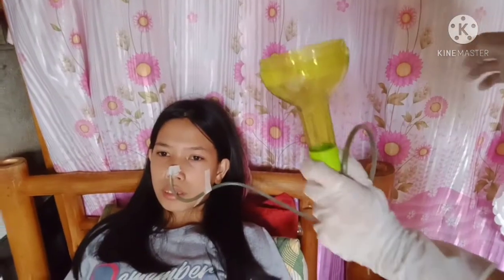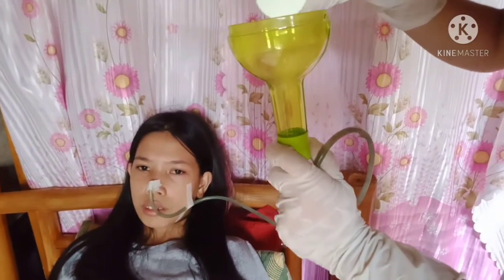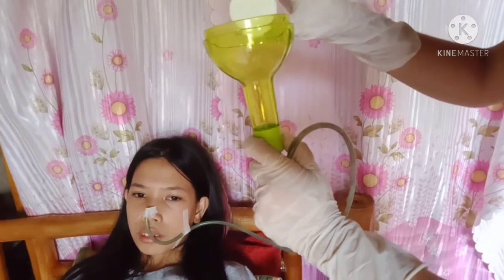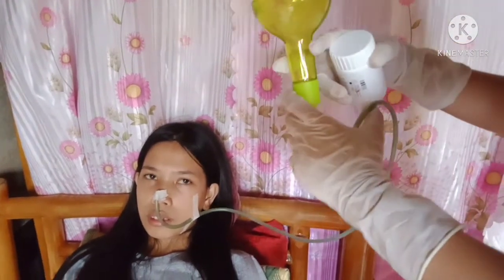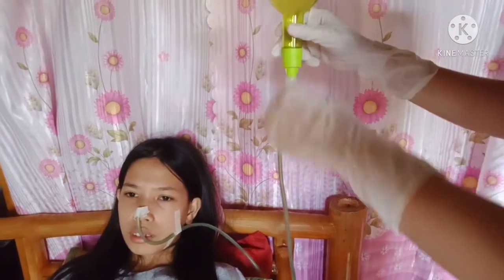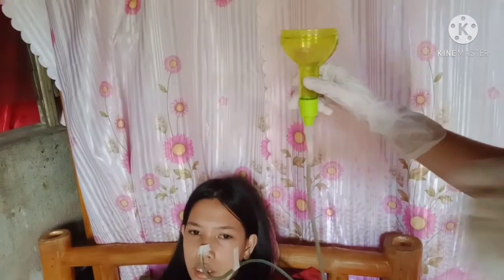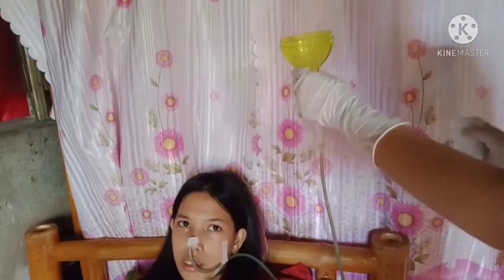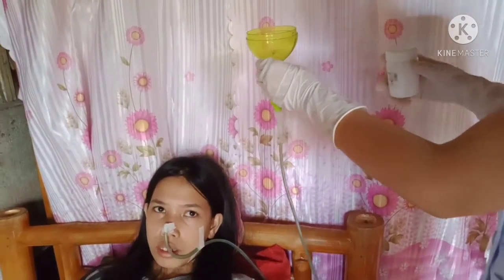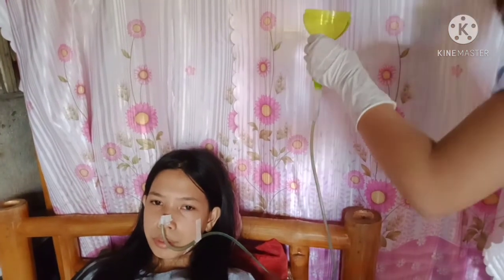So after that, we have to fill the syringe with the measured amount of formula. And then, release the tubing and hold the syringe high enough to allow it to empty gradually by gravity. And then, we have to refill and repeat until the prescribed amount has been administered.